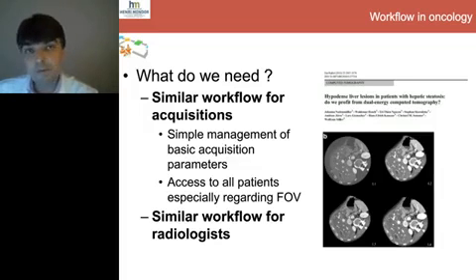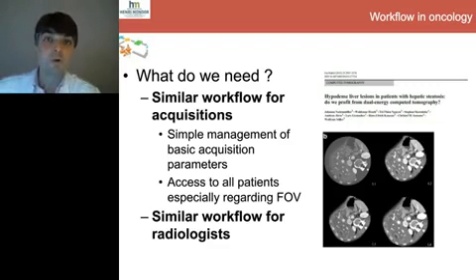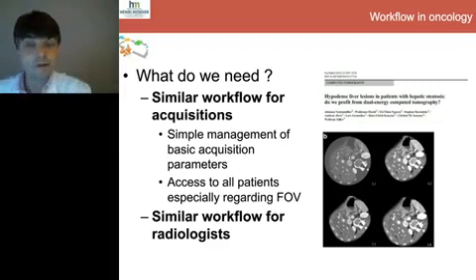So of course you can use different systems to make spectral imaging. You can use systems with dual tubes, but the question is, do you have the same field of view? And here's an example from the literature showing, maybe in certain situations with patients with large habitus, how you should cope with a small or reduced field of view in those systems, especially those with dual tubes, where you have to reduce the field of view and position a patient in certain conditions so that it actually fits in clinical practice. So the clinical information is probably the same, but the way you have to organize your workflow is different.